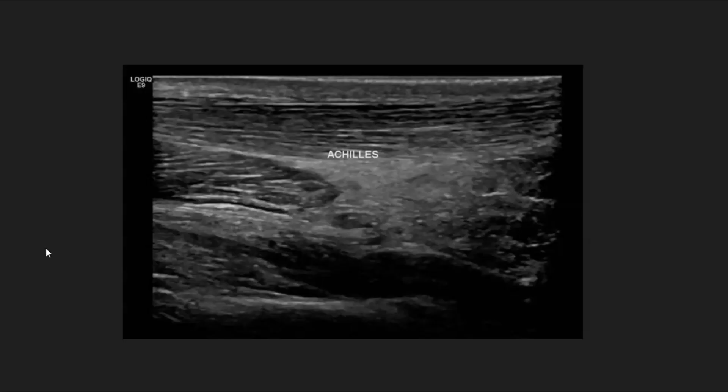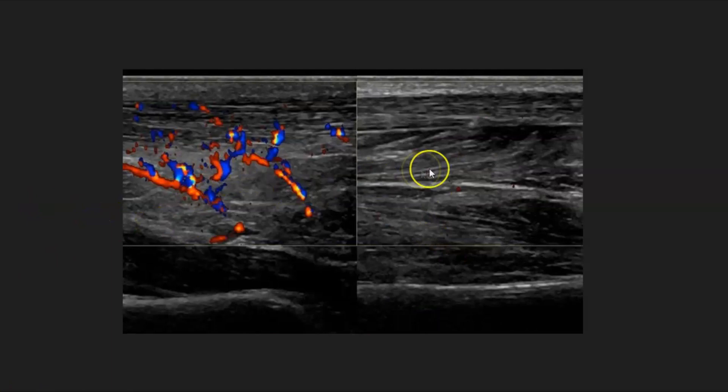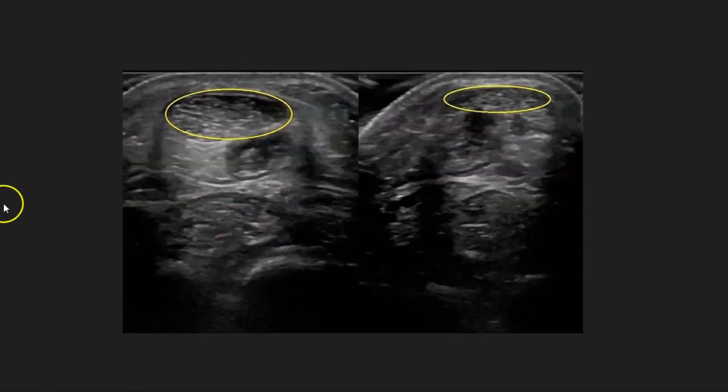Here we have an example of an Achilles with somebody with pain in the Achilles area in the back of the leg. You can see the Achilles right here. The Kager fat pad is a little echogenic, so that's probably inflammatory changes. With color Doppler, you can see there's hyperemia, none on the opposite side. In a side-by-side transverse comparison — this is right, this is left — you can see the Achilles tendon on the right is a little bit bigger than the left, and the Kager fat pad is echogenic when compared to the opposite side. This is a case of Achilles tendonitis or peritendinitis.